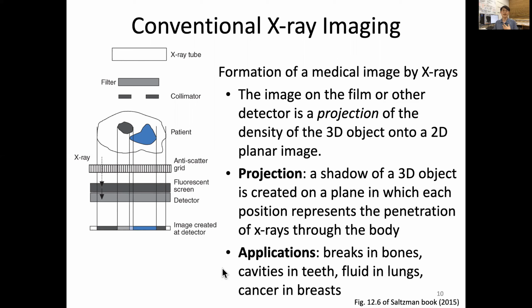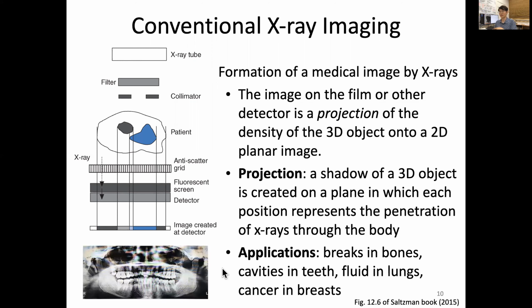So I brought one example of my teeth from a dental X-ray. With this, the X-ray source rotates around my face, and it takes this X-ray figure.